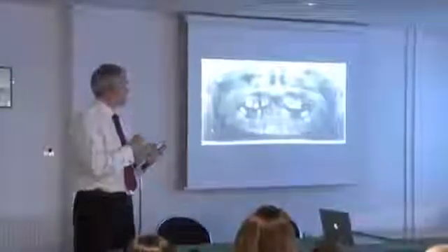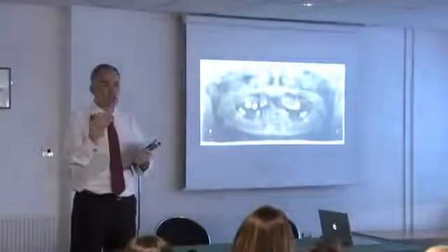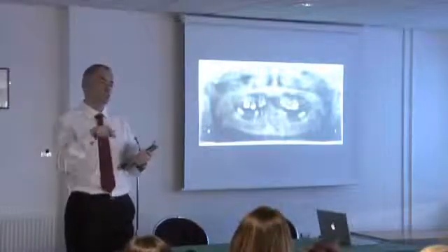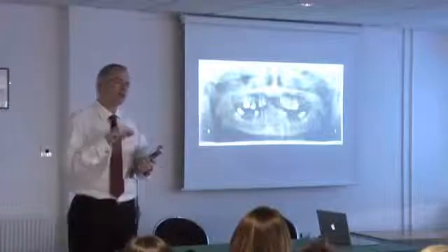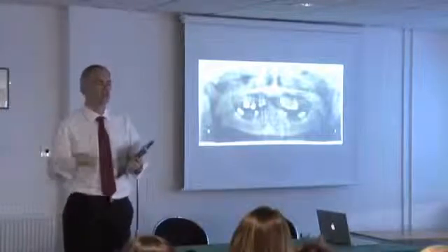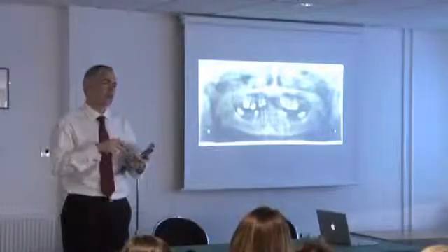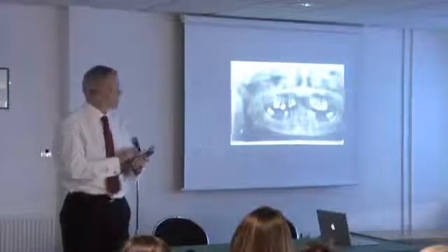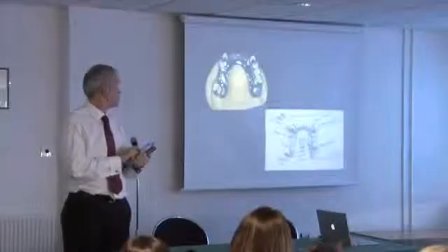So we had to do a bit of tidying up. I had to take some teeth out, I had to tidy up some fillings. But the design that I decided to come up with was something that was going to lock all the teeth together, as I've shown you the example, but give her all her occlusion on the denture. So I wanted to splint every tooth together as if you were doing a roundhouse bridge, but without the expense. And this is what we came up with.